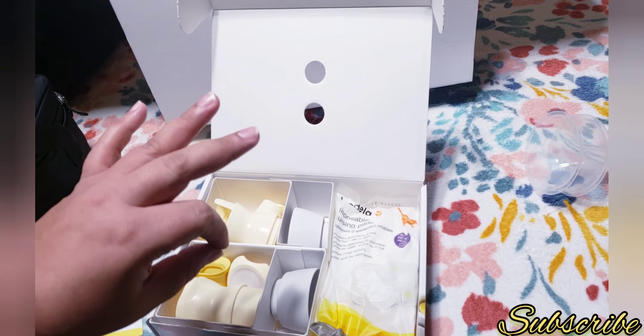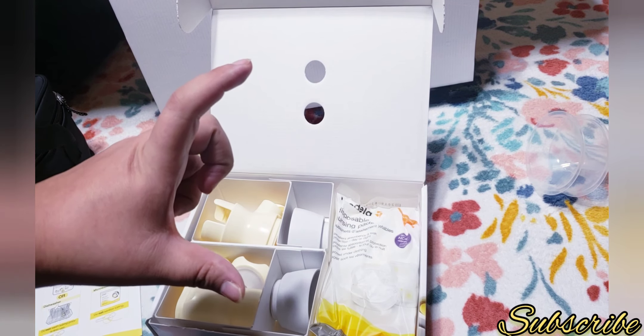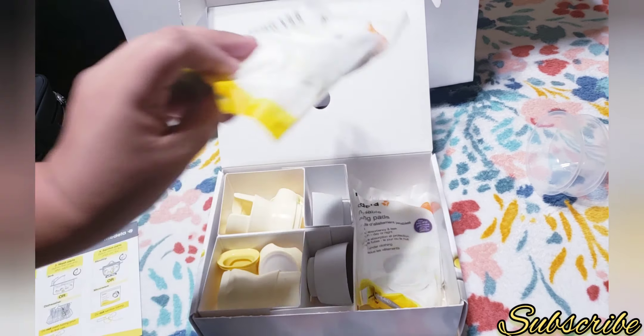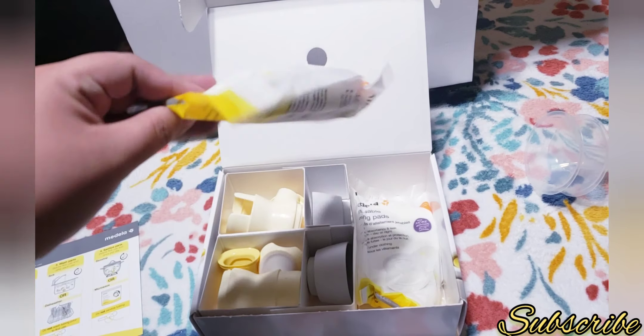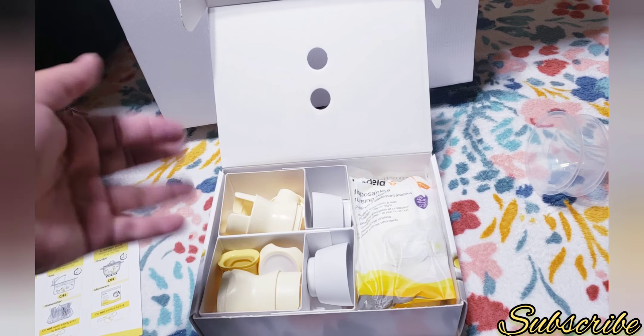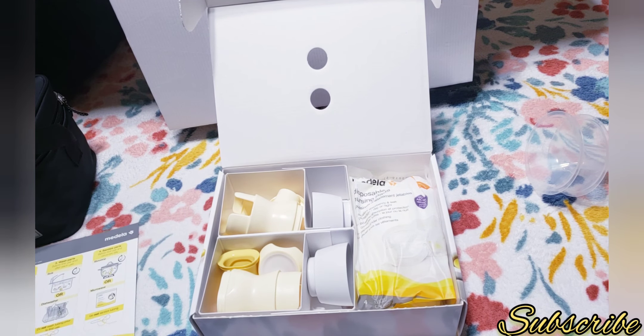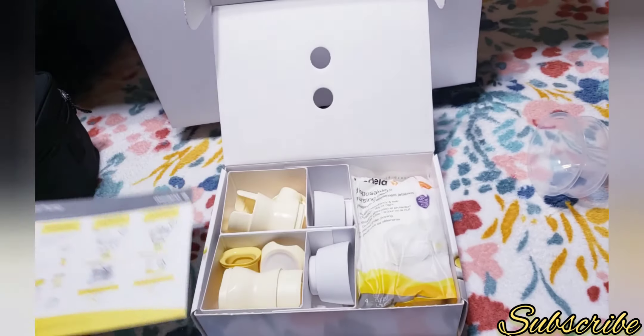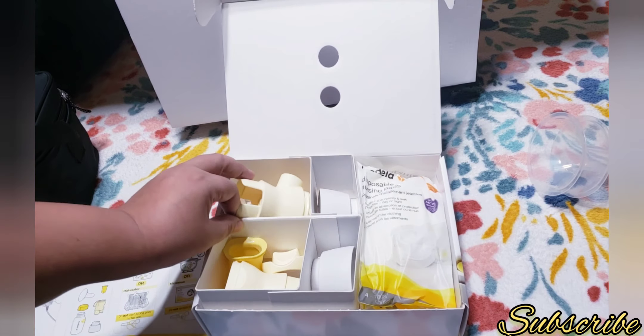The only things they didn't provide are the Medela milk storage bags and the microwave sterilizer bag. They should have included at least one of each so you could try them, and if you like them go buy more. But yeah, those are missing.